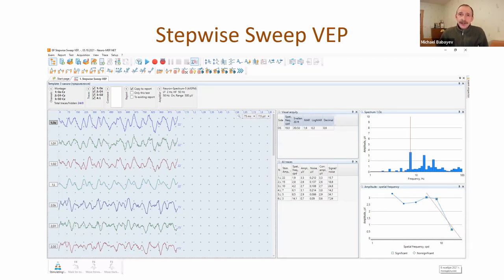Another technique: stepwise sweep visual evoked potentials. It is steady-state evoked potentials with reversal pattern, and this technique is useful for determining visual acuity objectively. Usually we try to define visual acuity with a table of characters, but sometimes it's not possible - for example, for small babies, children, and some inadequate patients. So you can use this stepwise sweep visual evoked potentials technique.